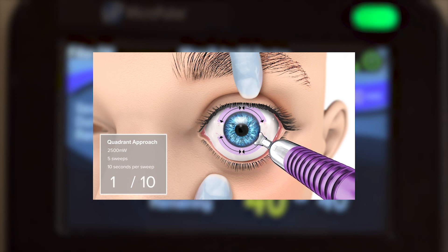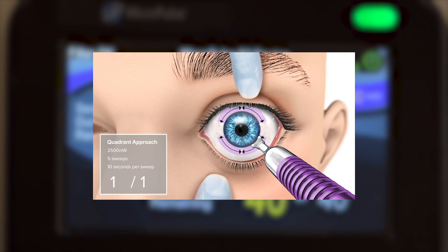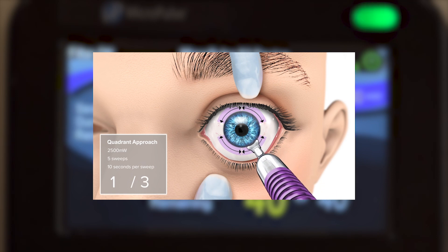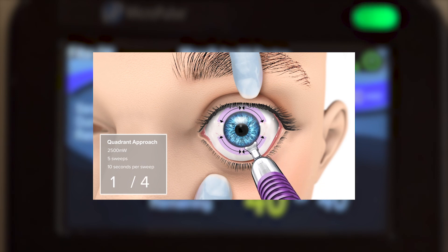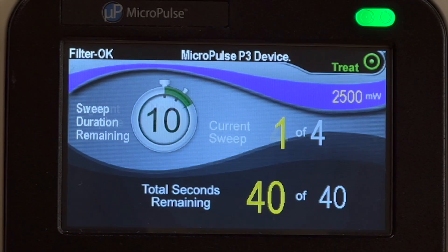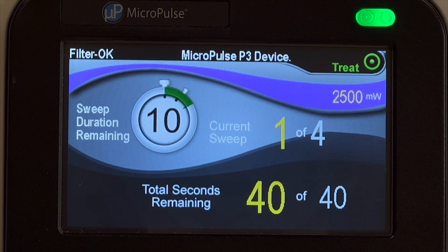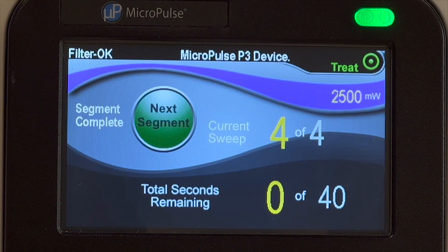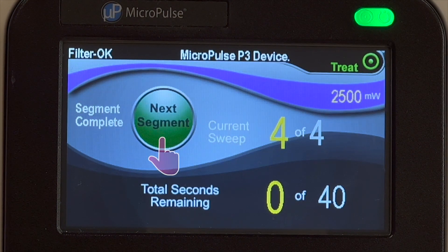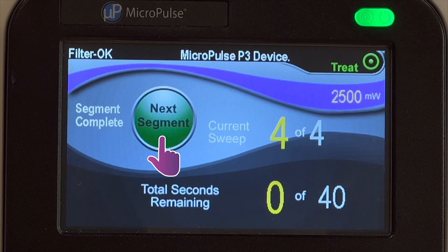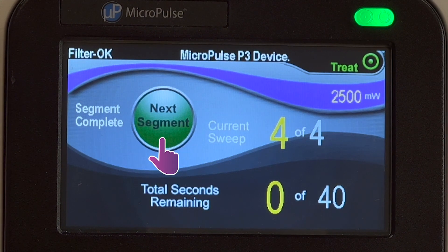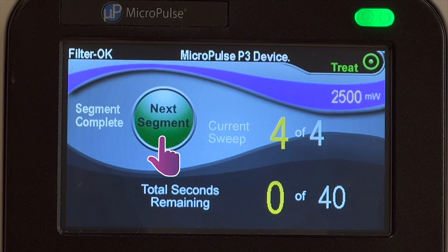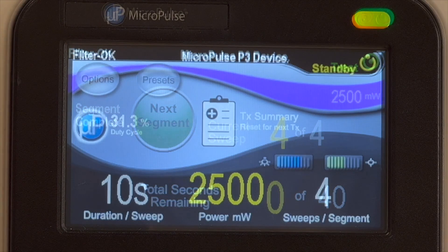The sweep management software offers a disciplined and reproducible approach of delivering Micropulse TLT. When treatment of a segment is complete, the stopwatch will change into a button icon that reads 'Next Segment.' Press on the button to reset all treatment variables to their starting values. Let's treat two quadrants so you can see how this all comes together.